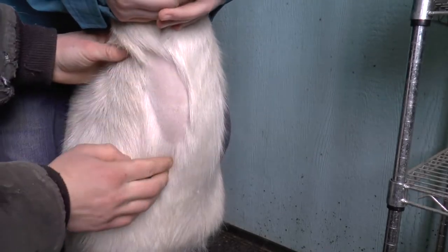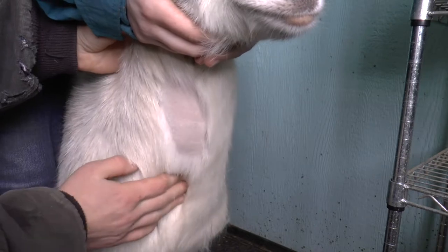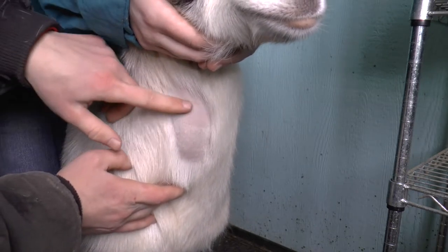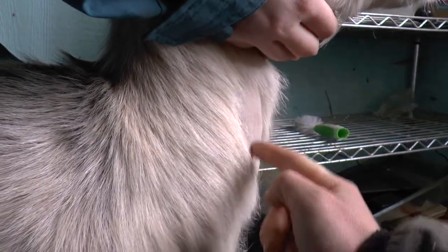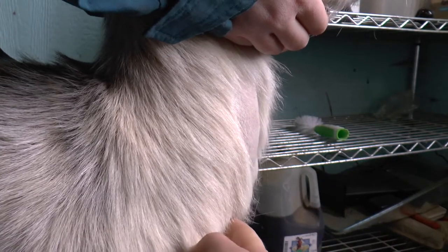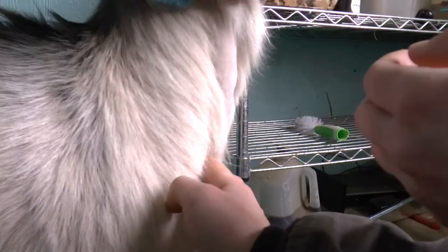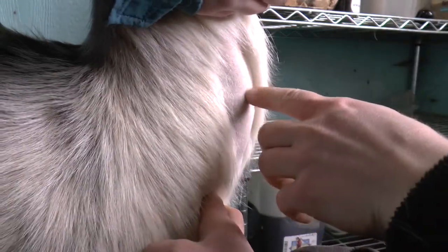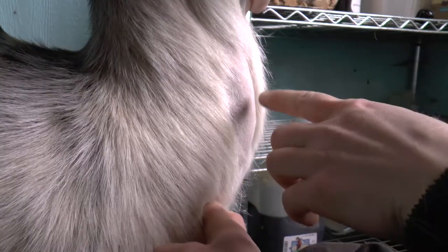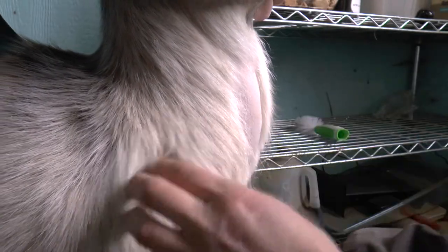If I follow this groove down — and hers isn't as noticeable because she's really tensed up — you can kind of see my fingers fall into this groove right here. Now, did you see that swell up? This is the vein right here. When I plug it off at the bottom, it starts swelling up right away. You can see it's all swollen right there. Watch when I let it off and it goes right back down. So right here is where this vein is, and we're going to be sticking our needle into it.